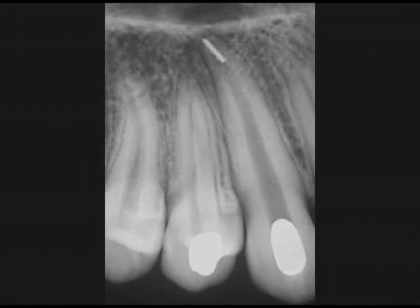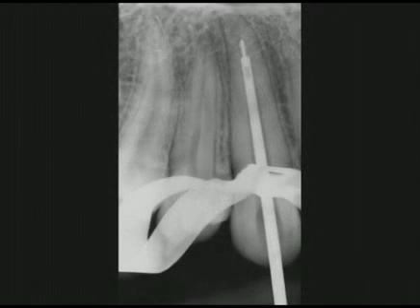Here's the preoperative radiograph of a temporized maxillary canine and an instrument broken deep in the apical 1/3. A working film shows that the IRS has successfully engaged and partially elevated the deeply positioned file segment.